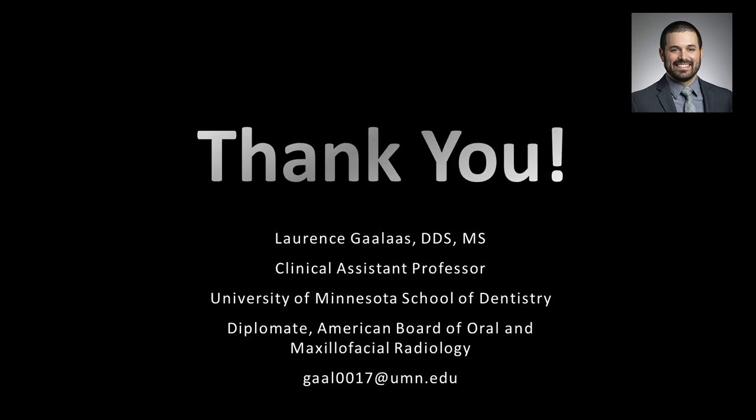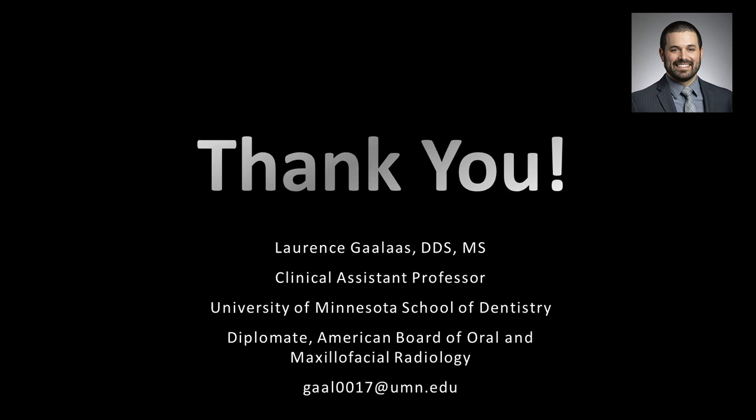Our next question is, can you address appropriate methods for sending images to be HIPAA compliant? Absolutely. There are ways to de-identify scan data and send it, but I do not recommend that for clinical reasons, because ultimately the point of DICOM data, which cone beam CTs are stored as, is that the patient information is tied to that scan. So we know who it is, we know when the scan was taken, with what scan parameters, et cetera. So whatever transfer system you're going to use would be the same way you would transfer PHI via email. If you have a secured email platform that can handle large attachments, you can attach it that way. What we use is a platform called ShareFile, which is like Dropbox, but it is HIPAA compliant.